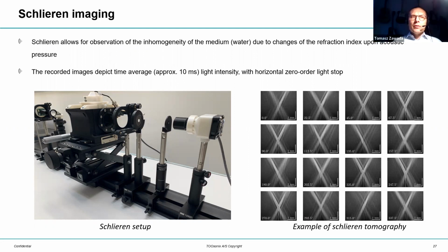Well, the answer is very simple. There are some limitations to how far you can go with your measurement when it comes to hydrophones. They cannot take really high pressure fields, so you are limited to some kind of quasi-linear operation of your transducer. That's not enough to understand the full extent of the behavior, and especially the electroacoustic efficiency. That's why the real high power measurements are made using the radiation force balance. That allows us to pump as much power as we want. Obviously, we need to remember that we take it in a post-focal fashion, and there are some different things about how we deal with the target. However, radiation force balance is basically the only good, reproducible, repeatable measurement that characterizes the overall average behavior of a transducer. So that would be the reason.